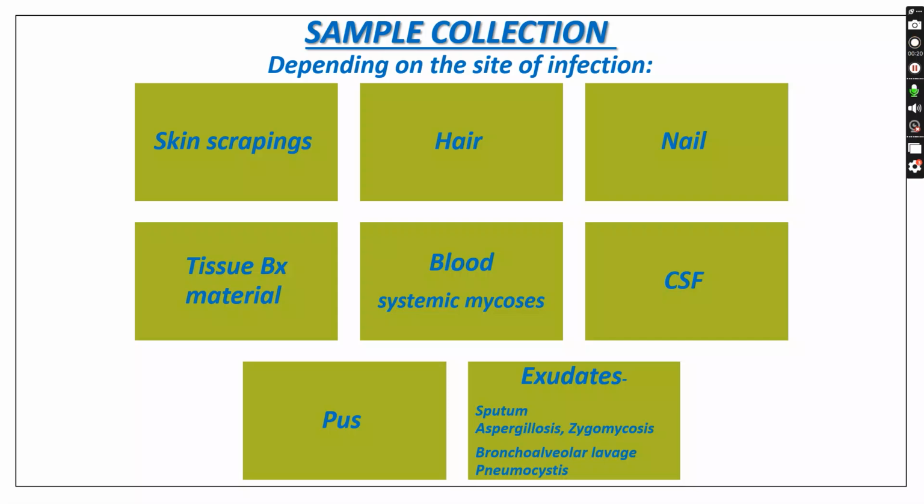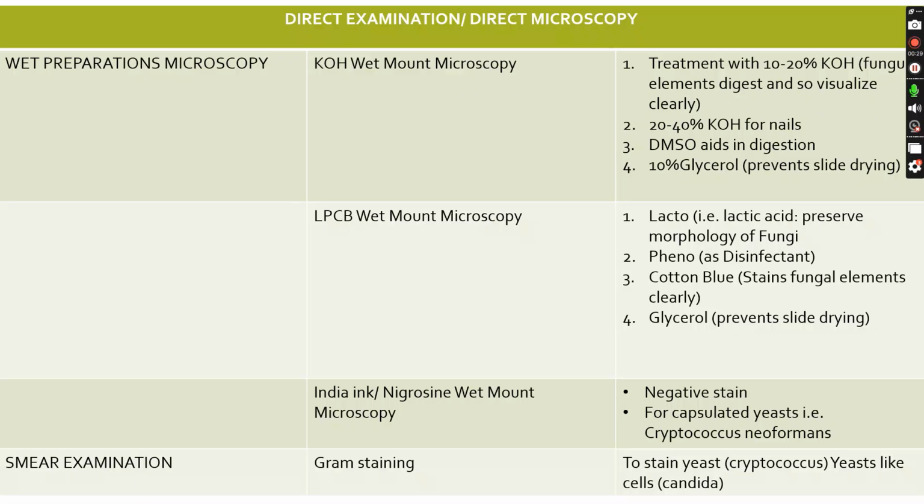Depending on the site of infection, skin scrapings, hair, nail, tissue biopsy material, cerebrospinal fluid, blood, pus and body exudates. These are the different samples which we are collecting.